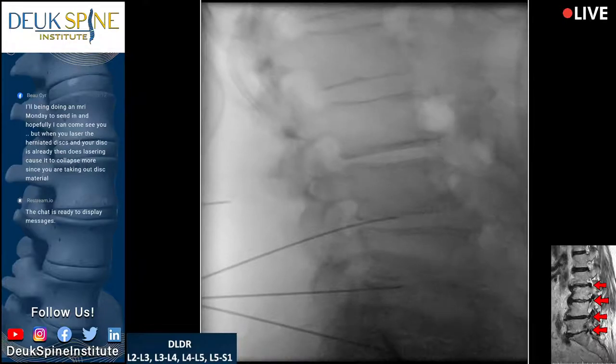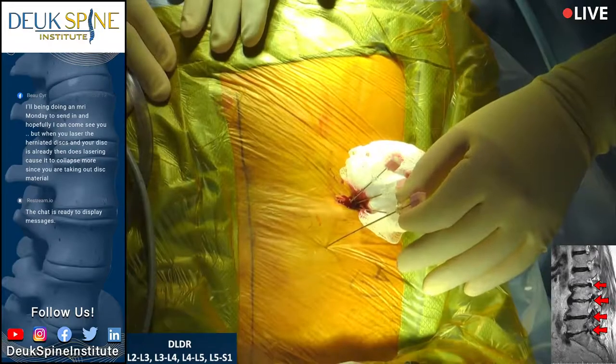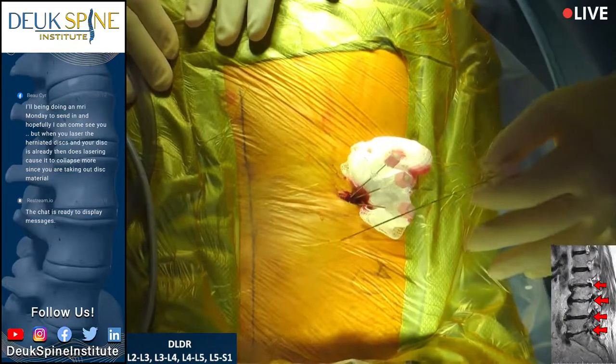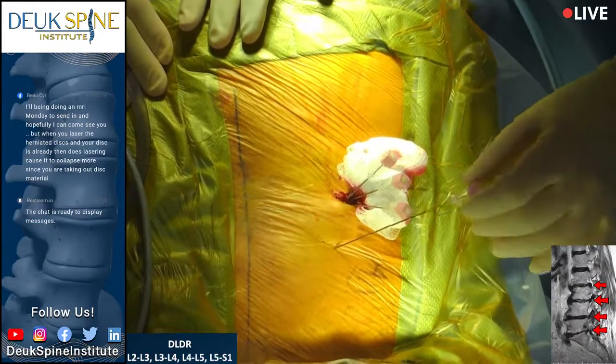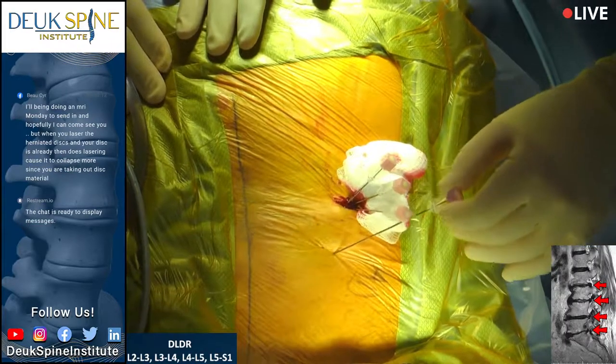That's a great question. Thank you for asking. The laser does not remove the disc. The laser removes the herniation. The herniation is not part of the disc. It's the part of the disc that's squeezed out, basically. So laser does not cause the disc to collapse more. Actually, it prevents the disc from collapsing more, because it's the arthritis, the inflammation in the back of the disc, that's the cause of the disc collapsing. So what I'm doing with the laser is getting rid of the cause or source of arthritis. We're almost done.